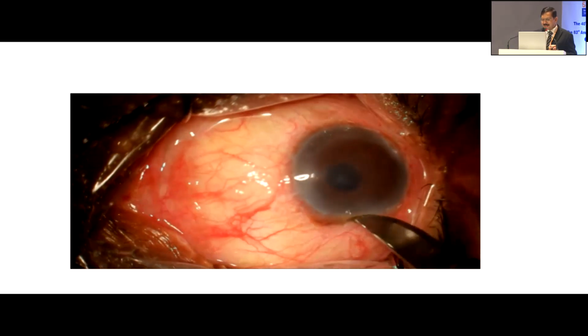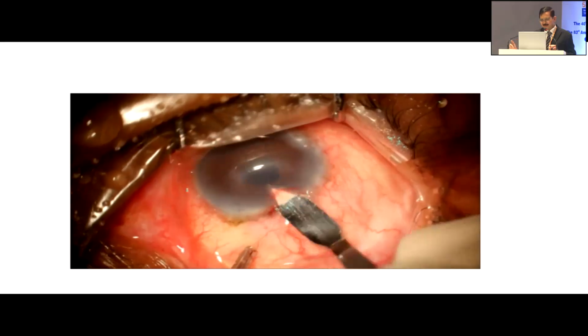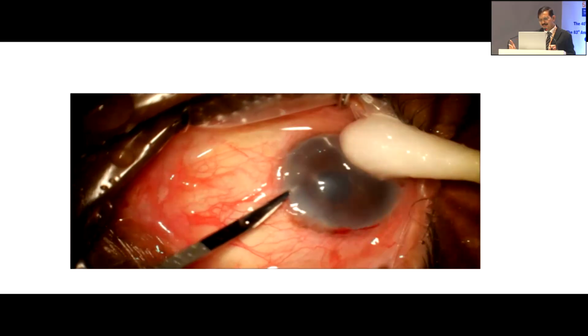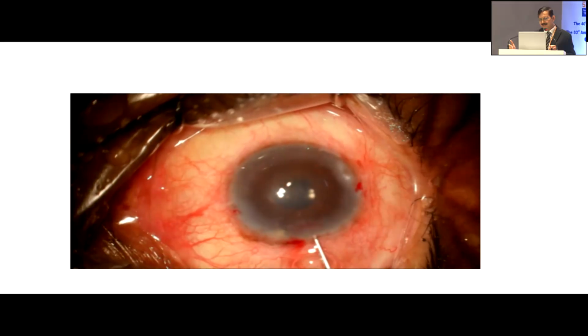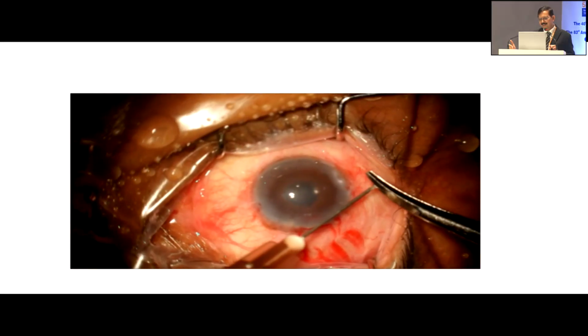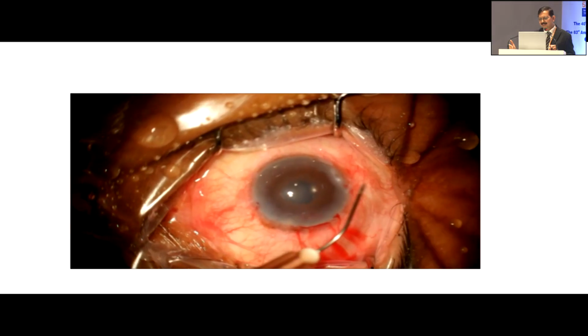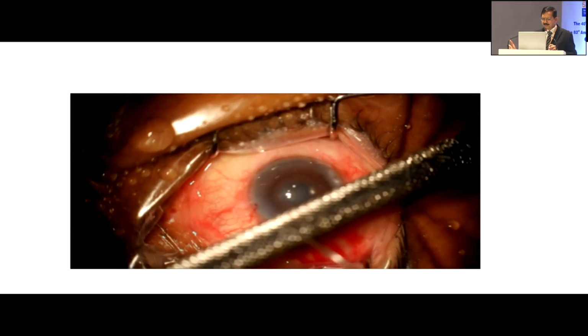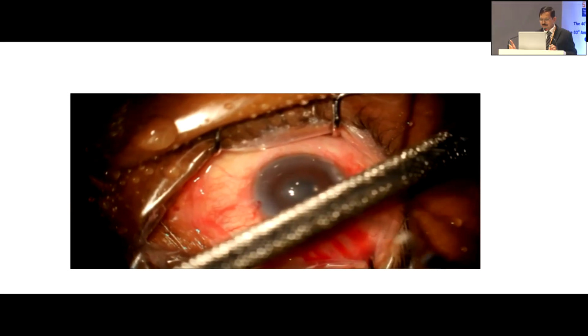So you need not make a scleral tunnel. You can make a clear corneal or limbus incision, then two paracentesis on either side, and then under saline you extend. This is the 26 gauge needle, the tip is blunted against a rough surface.